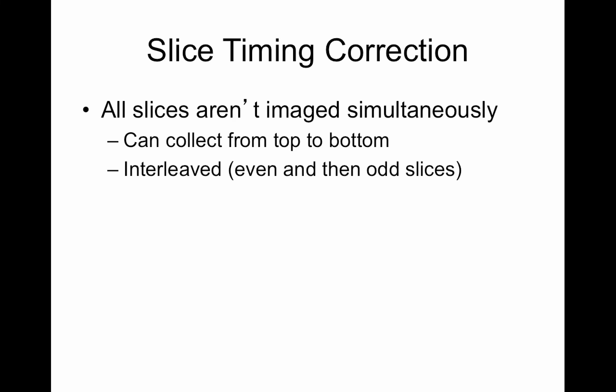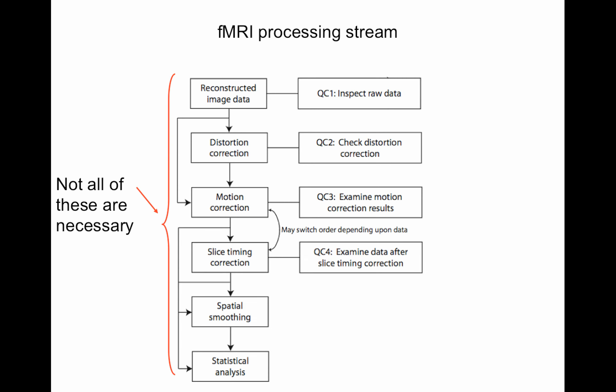Slice timing correction is what I want to focus on here. I skipped distortion correction, which I explained in the other video — I only go back and do that if my registration failed. I'll talk about the BBR registration, and once you see how that works you'll understand why it might fail if you have distortion in the data.